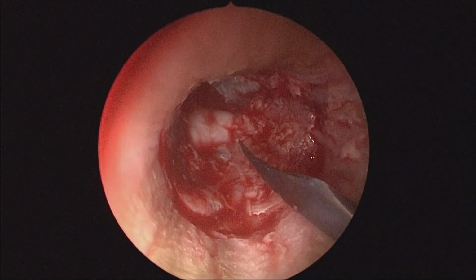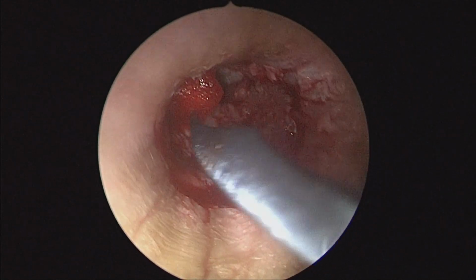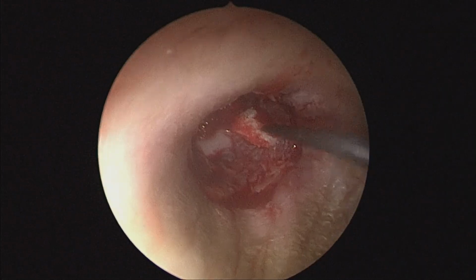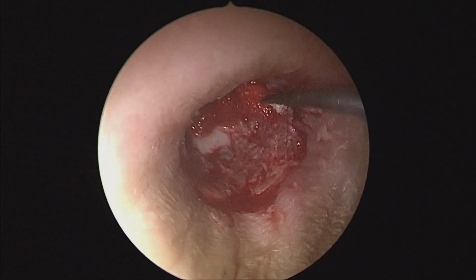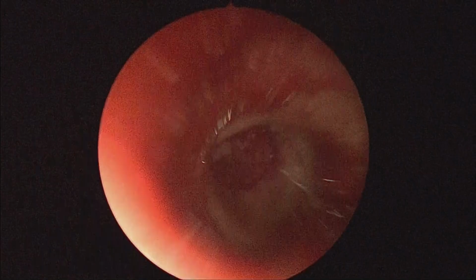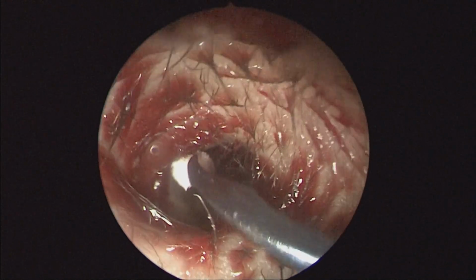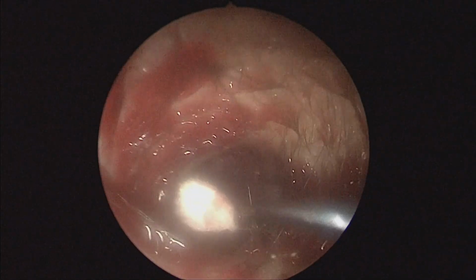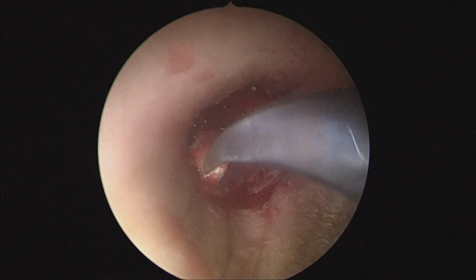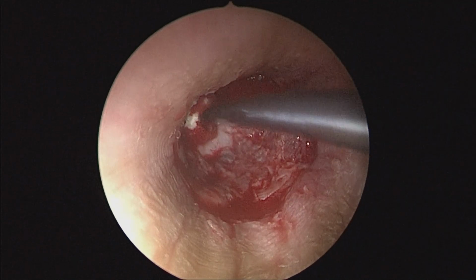Post this, you would just use some dry gel foam patties to place on the edges, first of all, of the graft and tympanomeatal flap junction, as well as in the anterior recesses. Now, gel foam has not to be placed to force it medially, but just to be kept gently over the intersection of the graft and the tympanomeatal flap, as well as in the anterior recesses, so that it forms a nice firm seal for the first few weeks after surgery.